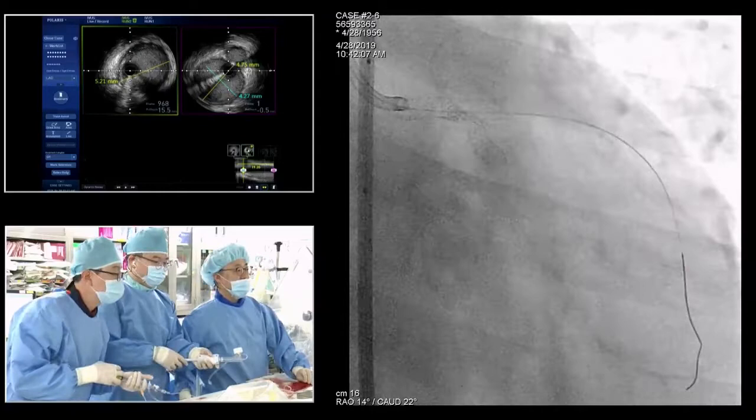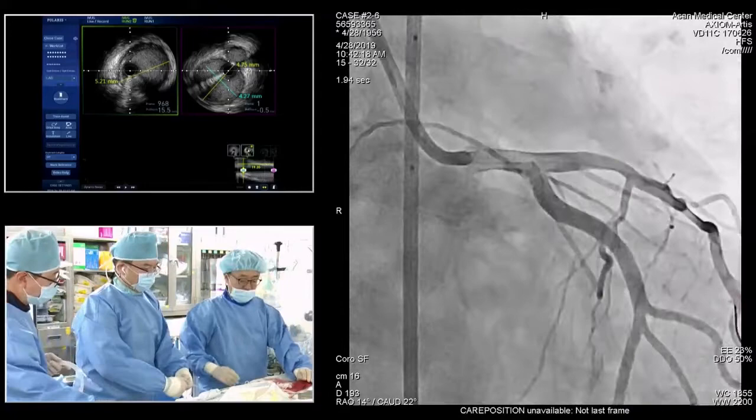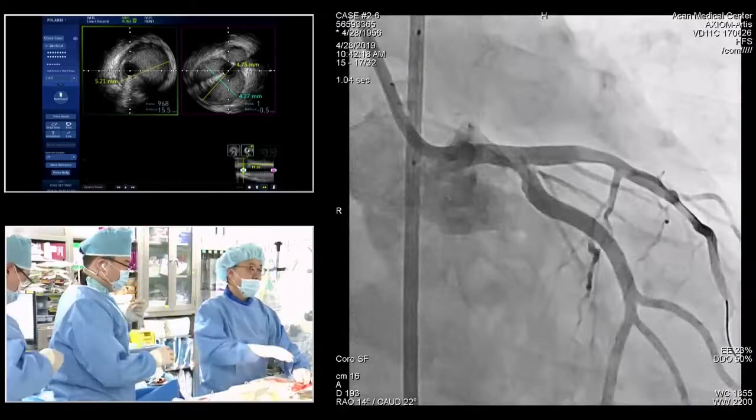And you're ready? Full shot. Okay, good. At this point, we're going to do a POT. Right. Using 4.5 and just 12? 10. Oh, 10? Okay, got it.